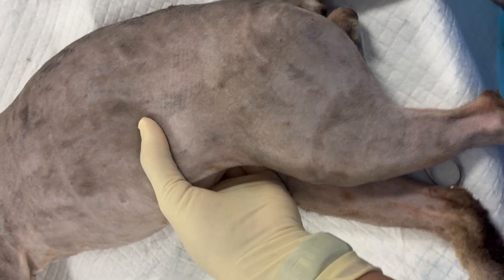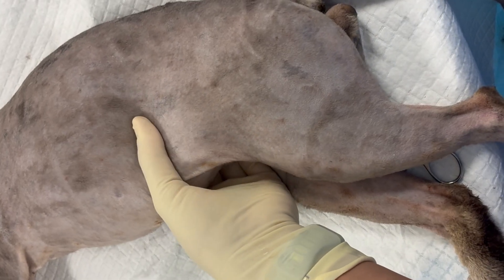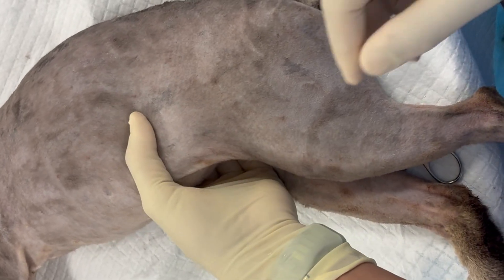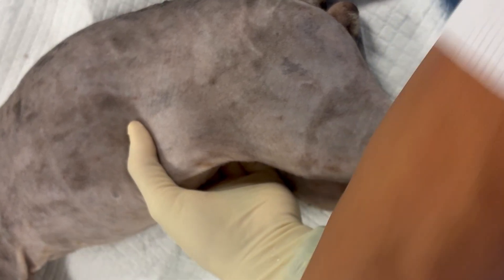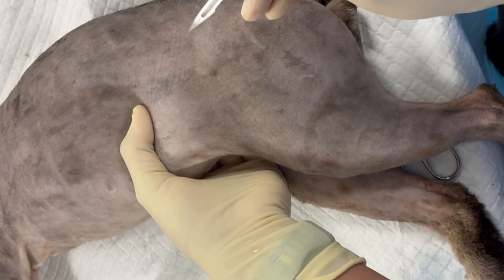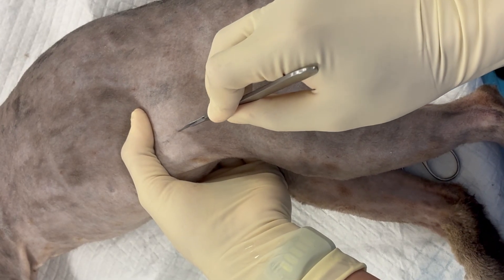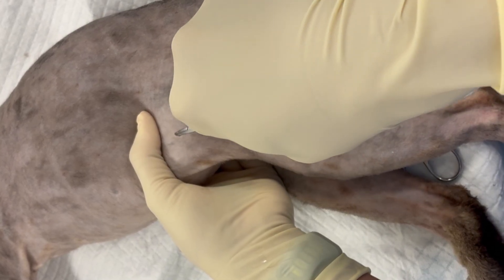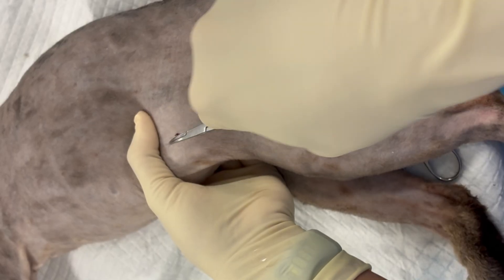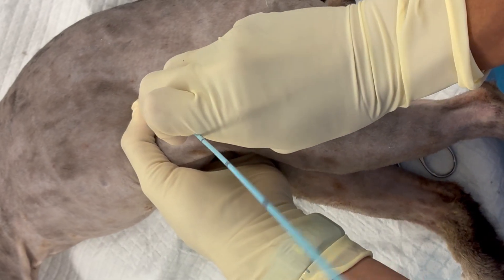Make sure that the needle protrudes at the end of the catheter. With the patient prepped and in lateral recumbency, we're going to grasp the bladder and push it up against the lateral body wall. Then we're going to make a small stab incision through the skin. In a larger cat, we might want to tunnel gently with mosquitoes through the abdominal wall, but not into the bladder.